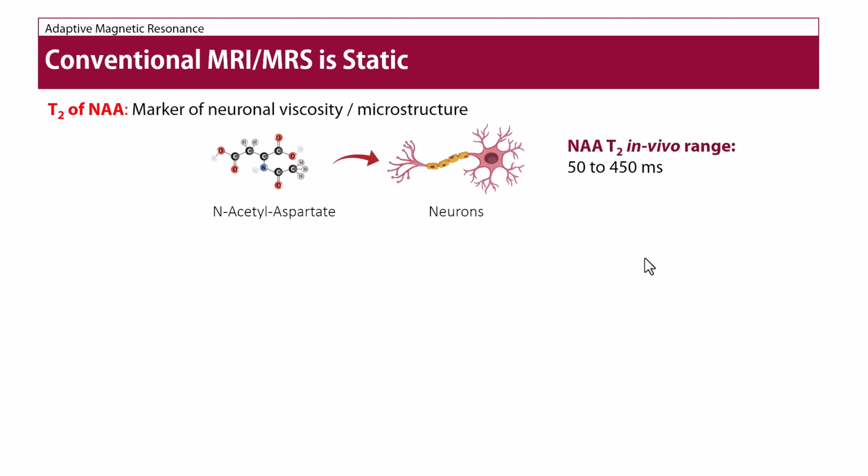I'm going to describe a particular application of this to the measurement of the transverse T2 relaxation times of the N-acetyl aspartate molecule. However, the ideas I will lay out are completely general and can be applied to any sequence and any type of contrast.